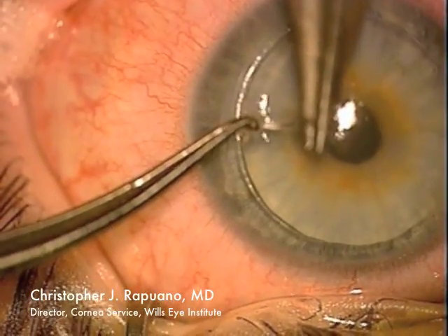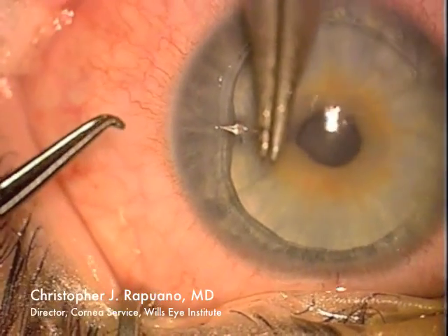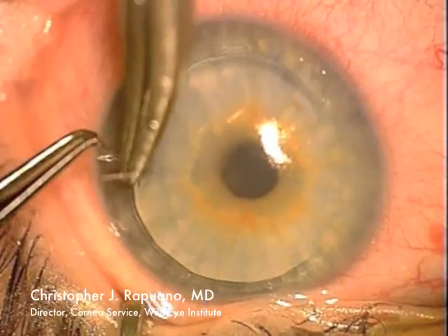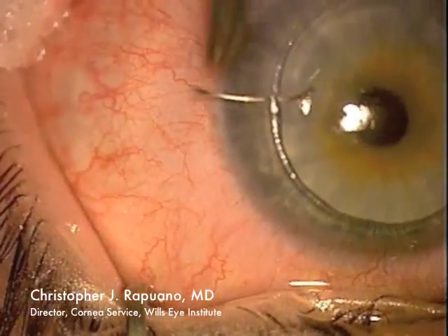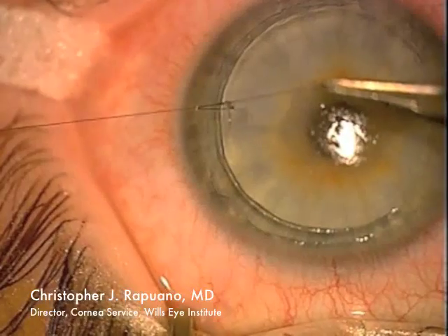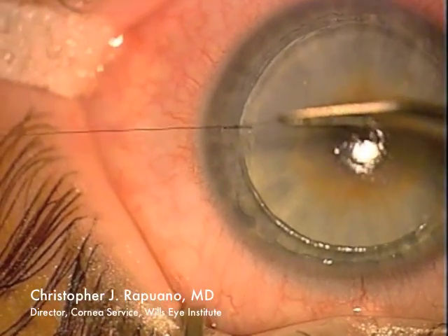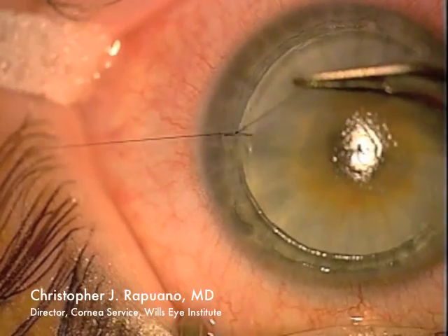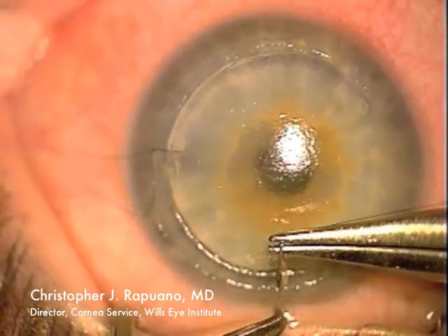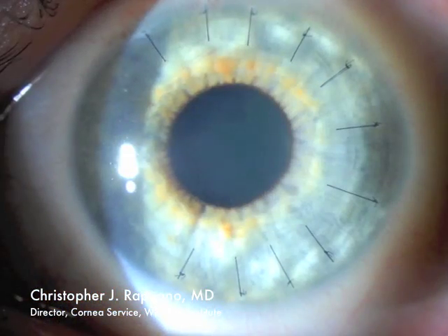I then try and lay the flap down in excellent position. Typically with a case like this, I will place numerous sutures and tightly suture them to secure the flap edge to decrease the chance of recurrent epithelial cells growing underneath the flap. I tend to tie these sutures rather tightly to secure the flap edge and decrease the chance of cells growing underneath.